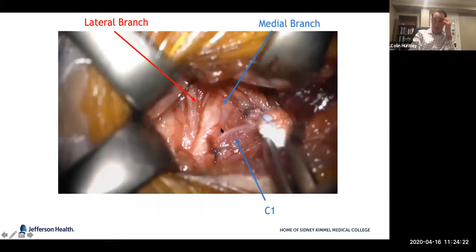So this is just an intra-op picture. This picture and the intra-op video that I have are courtesy of Clemens Heiser, who's in Germany. He does all these procedures with a microscope, so he's able to get very nice pictures and video. The quality is amazing. We do them with loupes, so I use either 2.5 or 3.5 loupes. I think at Pittsburgh, they don't use loupes at all. I think Ryan Soose just has Superman eyes that he's able to do this because he's very successful and very good at managing these patients. But most people around the country will use loupes.